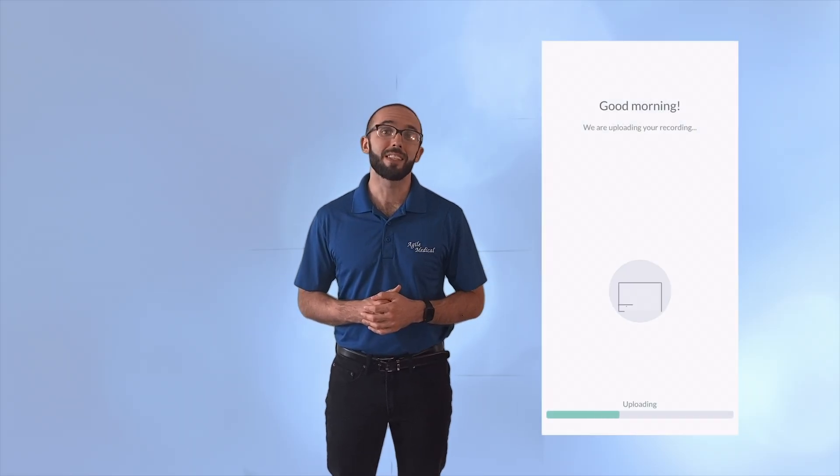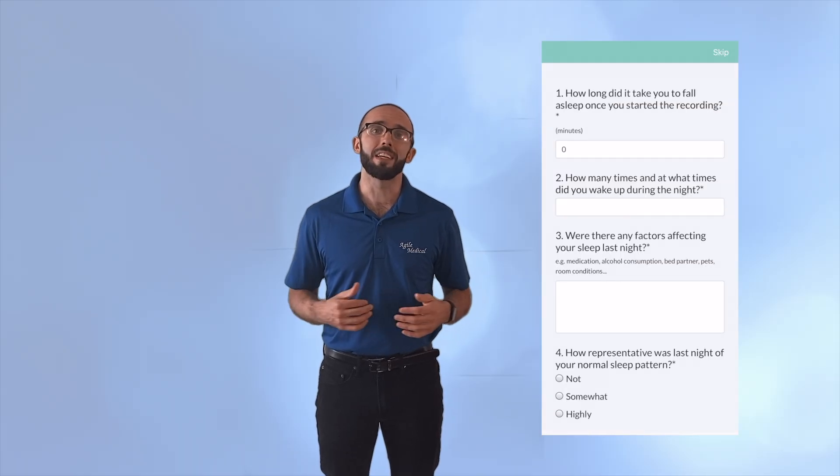Once you follow all those steps, press start recording in the app to begin your home sleep test. In the morning, press wake up to upload your recording and stop the test. The app will ask you a few questions about your sleep. Answer to the best of your ability and then hit submit.